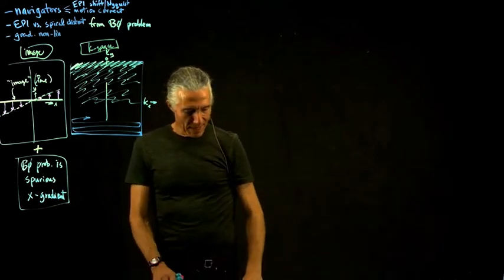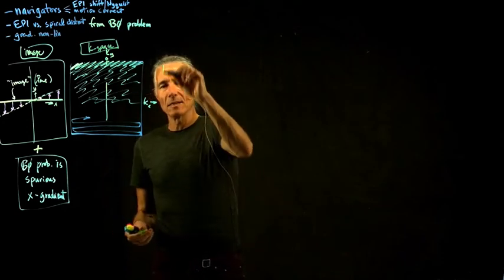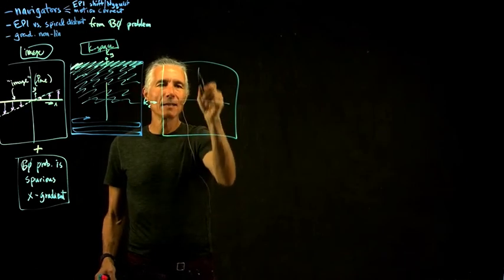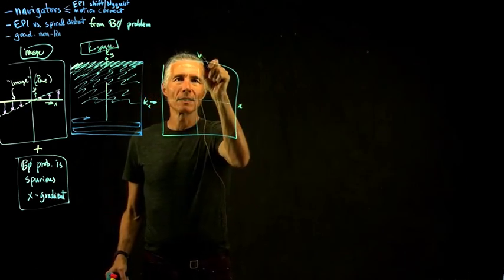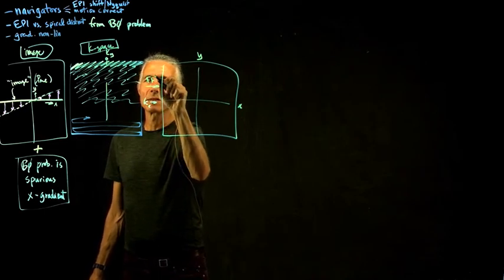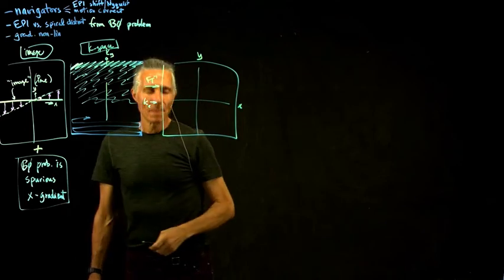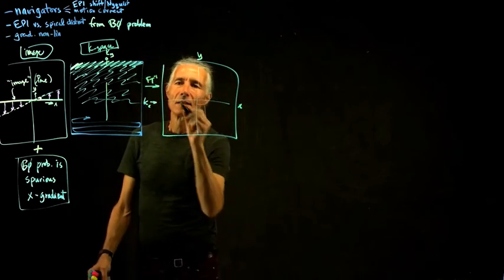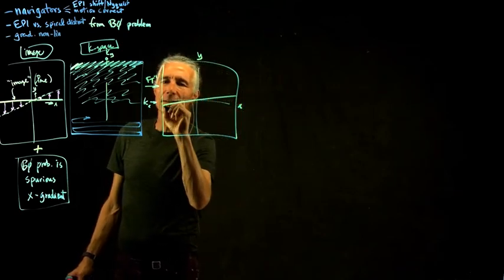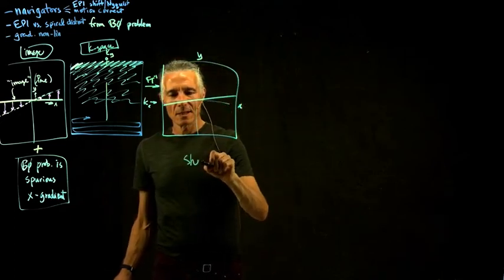And so when you reconstruct the image, what you're going to get instead of a line, with x and y, here's FT minus 1, is that you will just shift, you will shear this little bar. And so what you'll get is a shear.